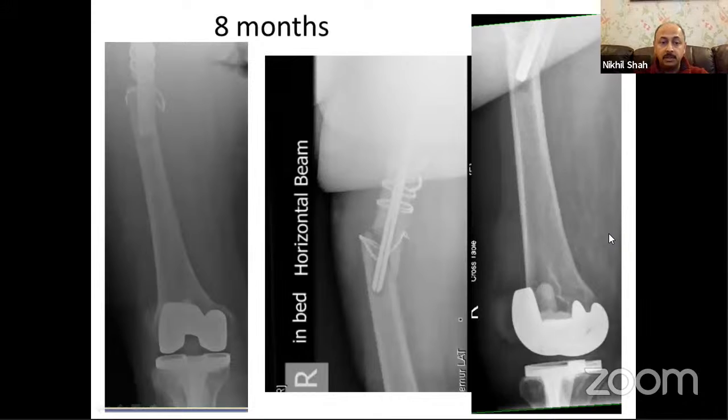And then within about 8 months, the fracture starts bending non-traumatically, and you can see that the stem is toggling distally and the whole fixation fails. Now this becomes quite a difficult revision because you've had an ETO, you've had a long uncemented stem, which is probably ingrown, and you have to try and put a stem in, and there's a knee replacement distally. And this case, I think I did this in 2011 or 2012 maybe.